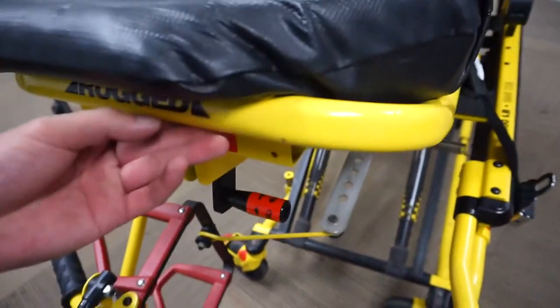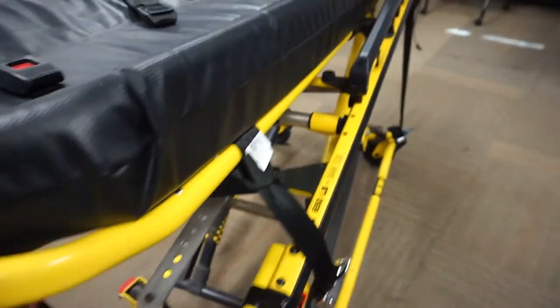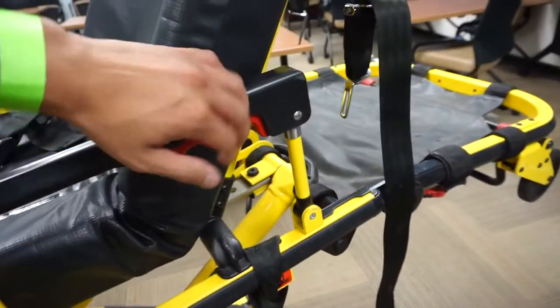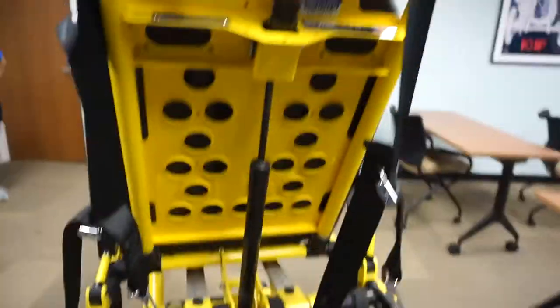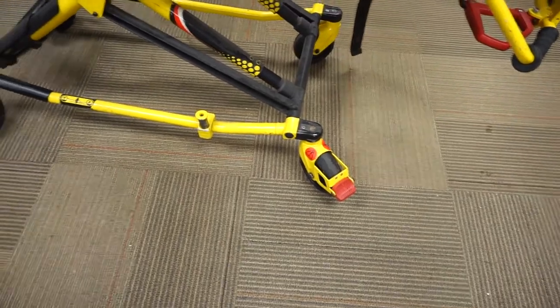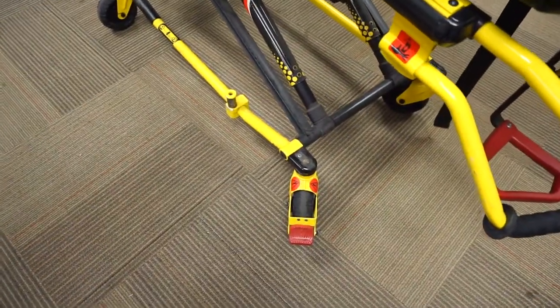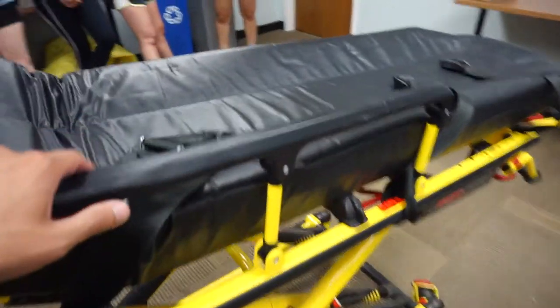The feet part of the stretcher can come up, but we don't teach or utilize this position anymore — this is called Trendelenburg, used to try to get fluid back to the core. We've got handles that can come up and down. There's a red handle on the bottom — so if you're in a tight spot, for example an elevator, we can bring that down and raise the head of the stretcher up and down. This is a rather older Stryker — newer ones even have a steering mechanism. To protect yourself, anytime a patient is coming on or off or is on the stretcher, we should always have at least two hands on it — whether that's your two hands or one of your hands and your partner's.